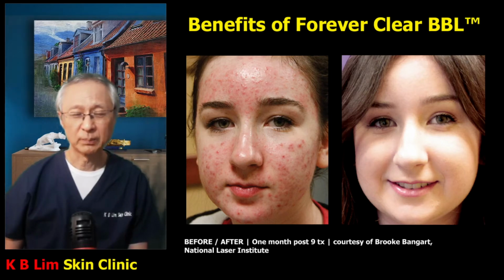So in many of my patients, I do a combination of a regular acne treatment with Forever Clear BBL treatment in between. So this seems to be more manageable for many of my patients.